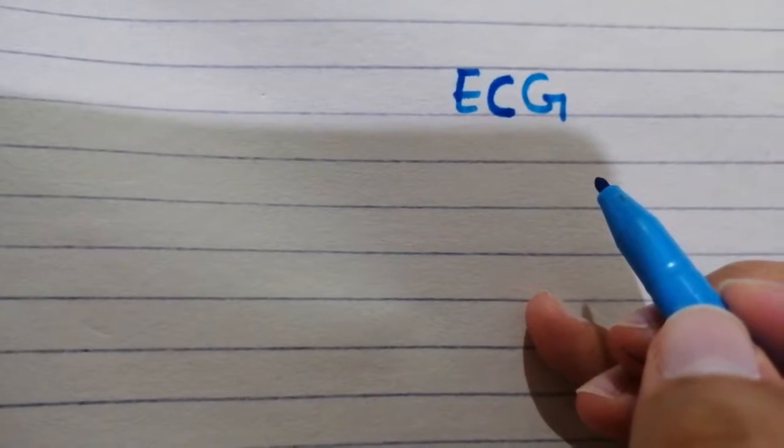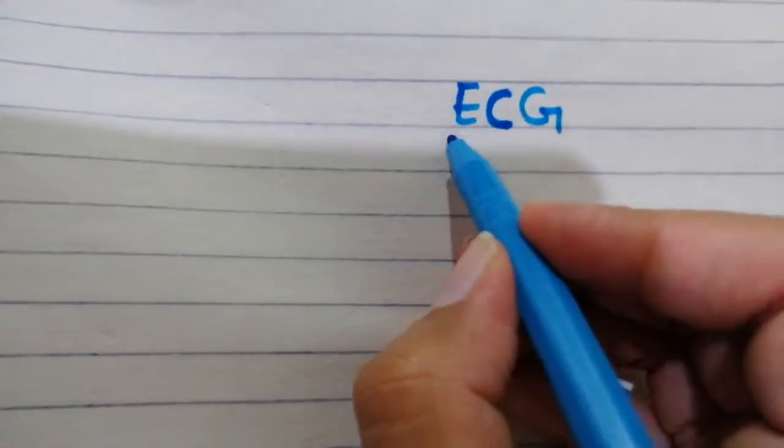So if one discusses the concept of ECG, what is ECG? ECG is basically a record of the electrical activity of the heart. So not the mechanical events, rather the electrical events.